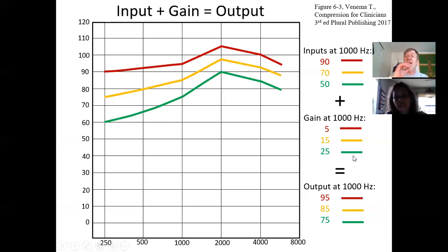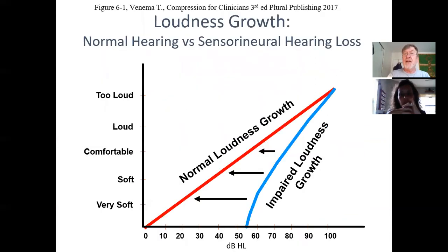So when you're reading outputs, the bottom output is always the target output for soft inputs, and the top output is always the target output for loud inputs. It kind of makes a lot of sense. It's just easier. The bottom one's for soft, the middle one's for average inputs. This is the target output for loud inputs. All nice, okay?